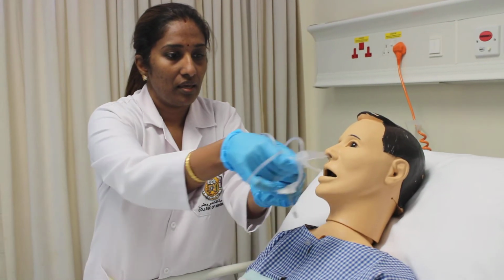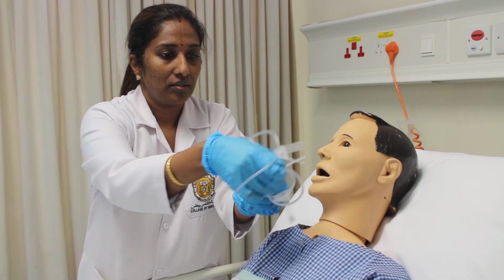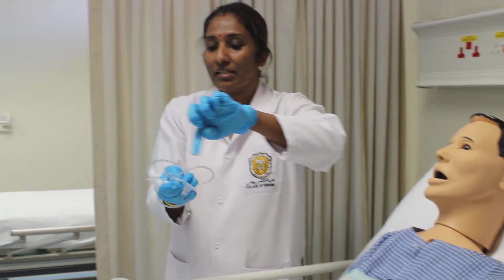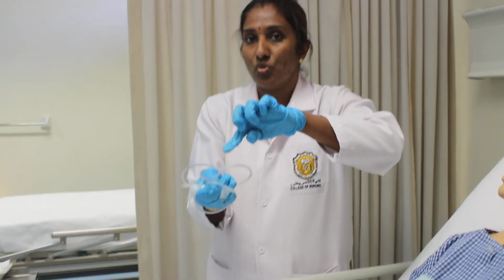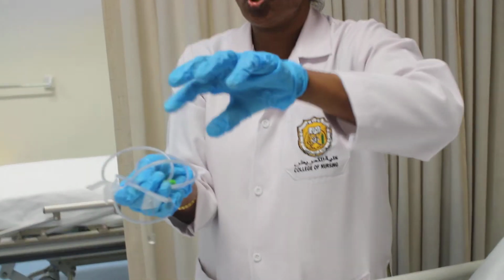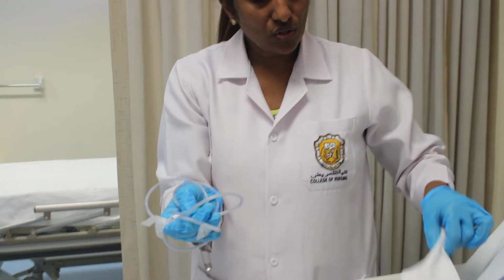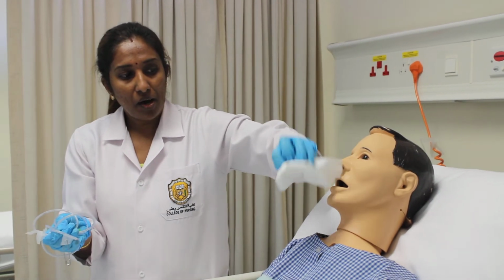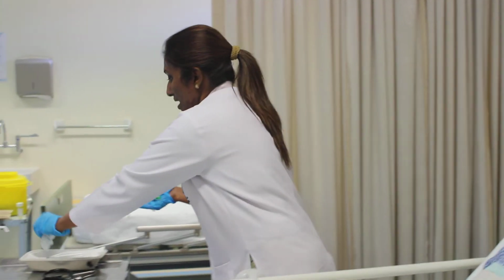So the tube is completely in your hand. Please check the tube for complete removal, that no part is missing. Also make sure that the patient's nose and mouth are clean.